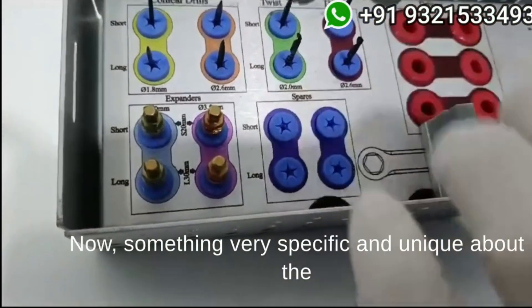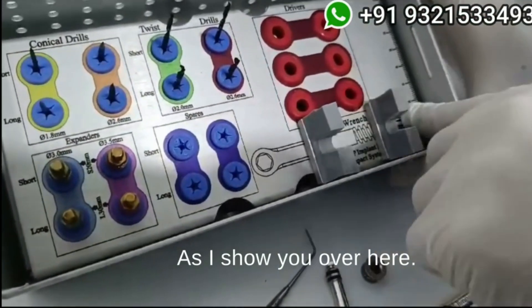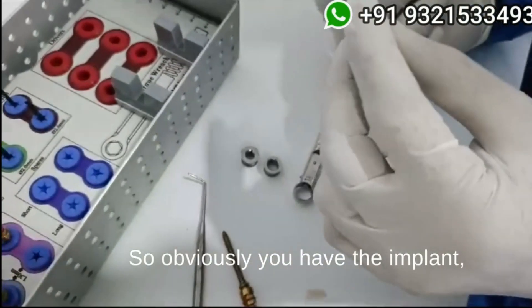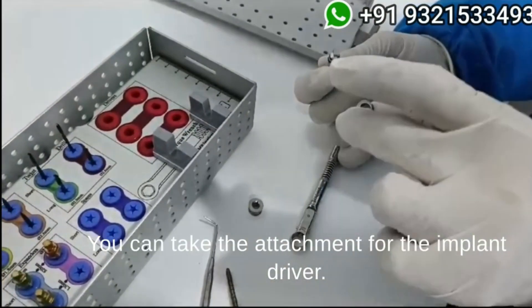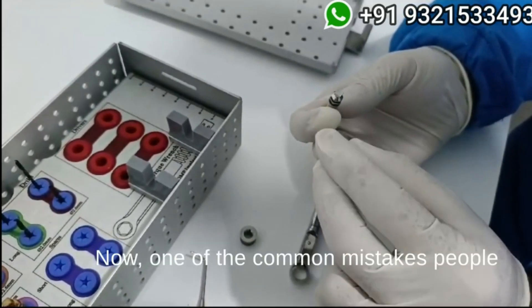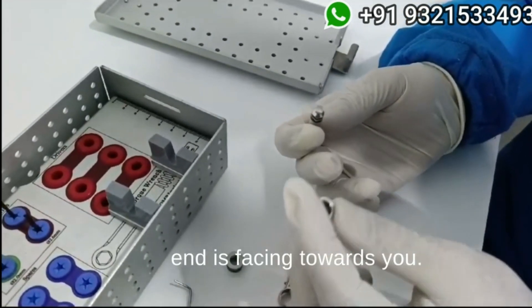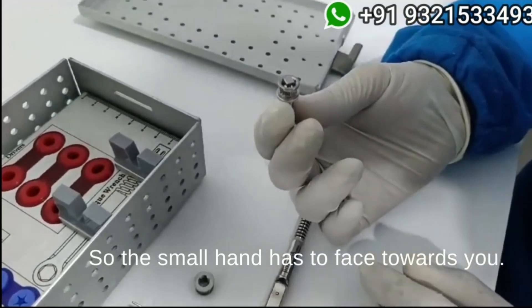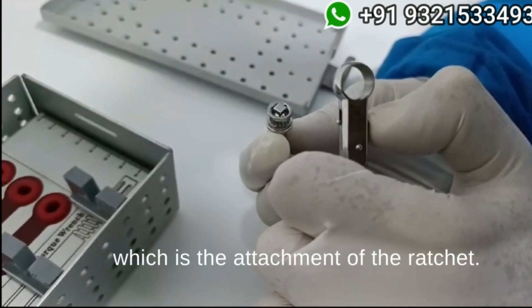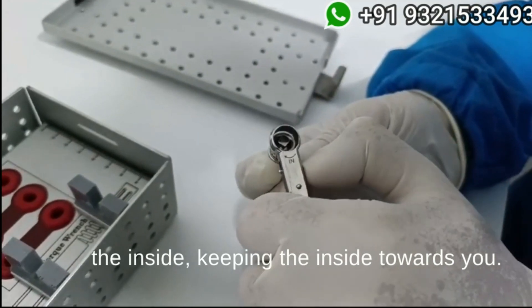Something very specific and unique about the ratchet is it comes with two attachments. So let's say you want to place the implant — you have the implant, you have the driver on it, and you take the attachment for the implant driver. One common mistake people make is they fix this attachment in reverse. Make sure that this small end is facing towards you. Then you pull this over and connect it to the ratchet by pulling the button back and putting it inside, keeping the inside towards you. Now your ratchet is ready.